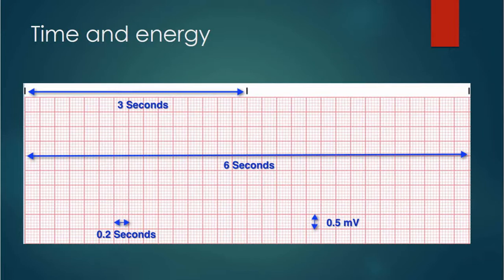6-second strips are very important because most of our ECG analysis happens in the 6-second time frame. Most of the activity the heart is giving off can be caught and diagnosed in 6 seconds. So when you're talking about your atrioventricular blocks, when you're talking about bigeminy and different things like that, you can usually catch it and diagnose that in the 6-second realm of things.